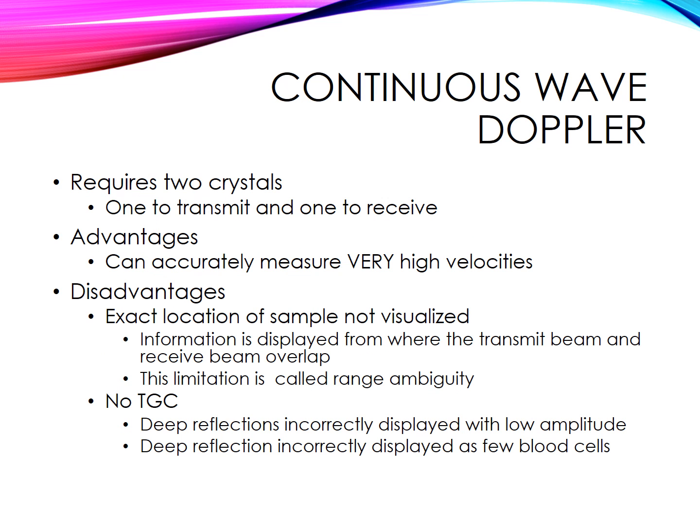So the first type of Doppler that we're going to discuss is continuous wave Doppler. For the purposes of general and echo both listening to this lecture, I will put out there that general ultrasound does not typically use continuous wave Doppler, but you are still required to know it. Echo tends to use this a little bit more, they deal with much higher frequencies, and we'll learn why they might want to switch to a continuous wave Doppler.